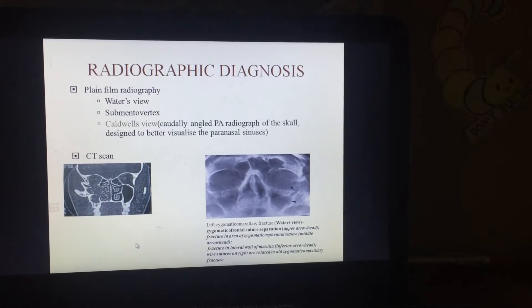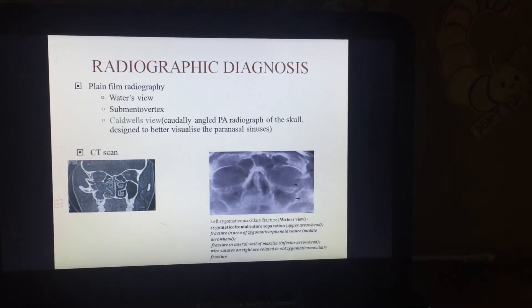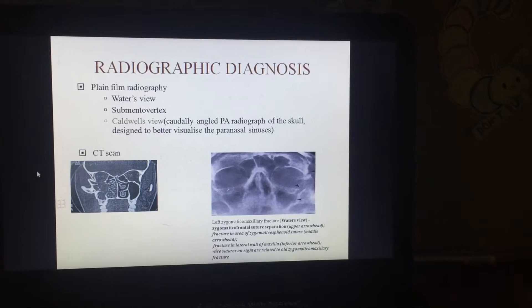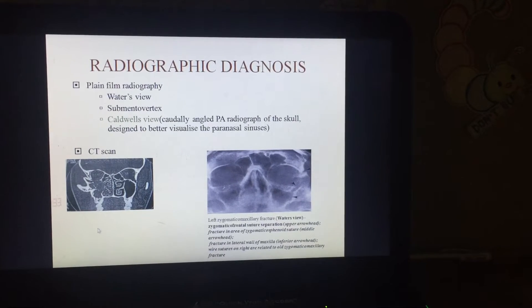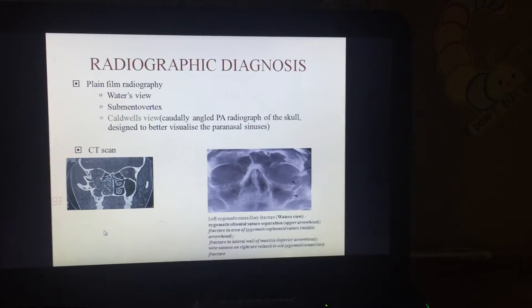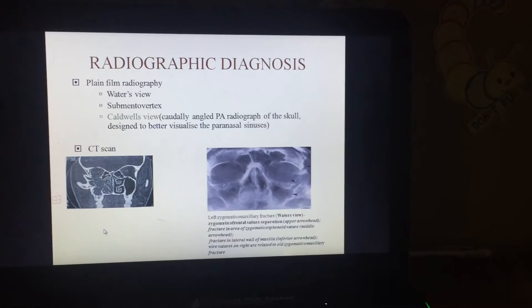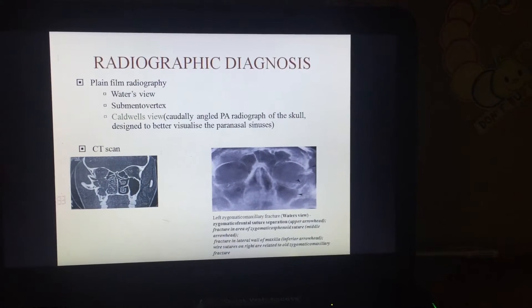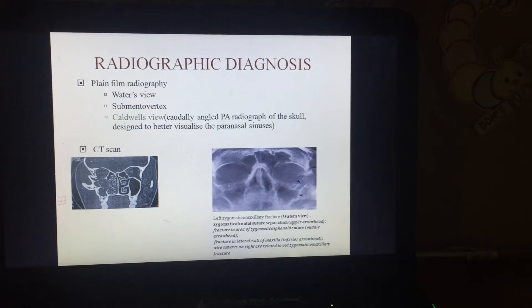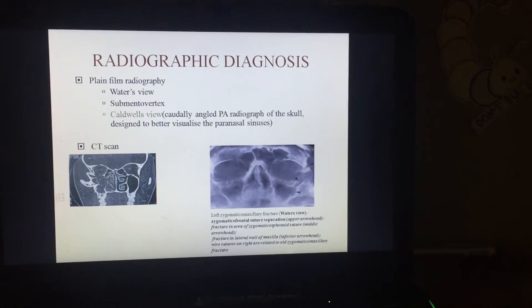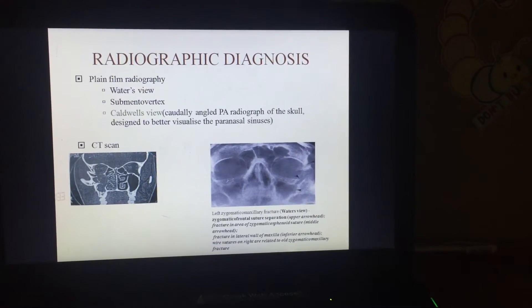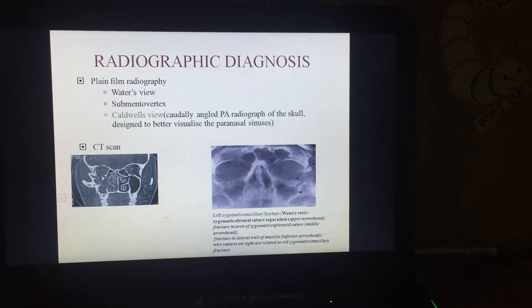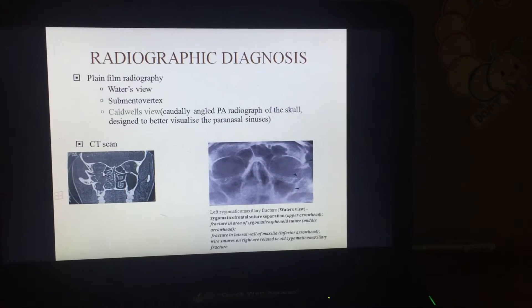CT scans are important because they give us slice-by-slice sections of the fracture areas, so we can easily interpret the level of fracture and what else has been fractured. For example, we are able to see that the orbital floor is fractured here.